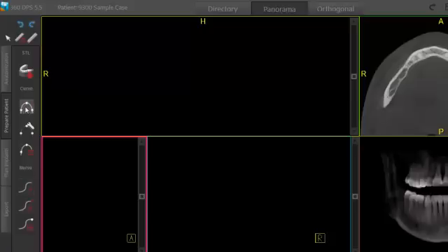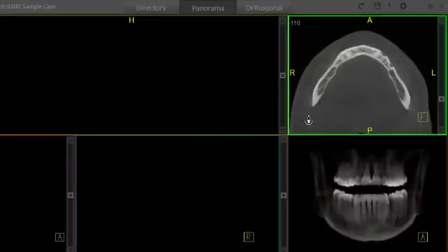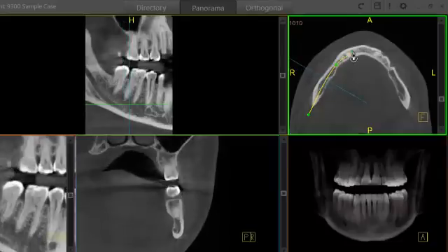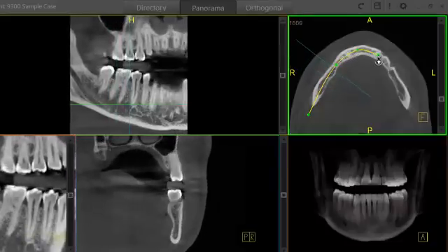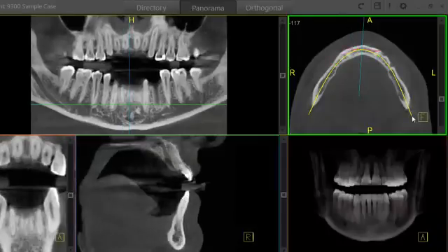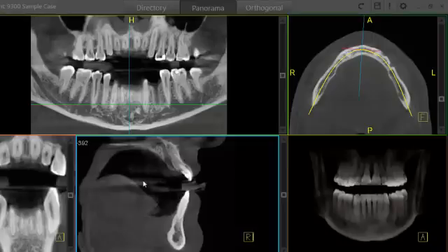To begin, I'll go ahead and draw our curve. Just select our curve tool, and then I'm going to use my ink cursor here to draw my curve through the mandibular bone. Double click to finish, and you can see now we have our pan, our cross section, and our transaxial view.